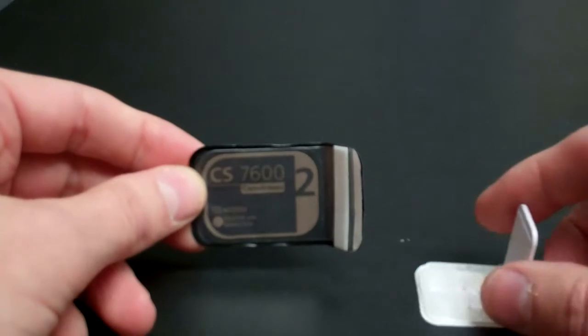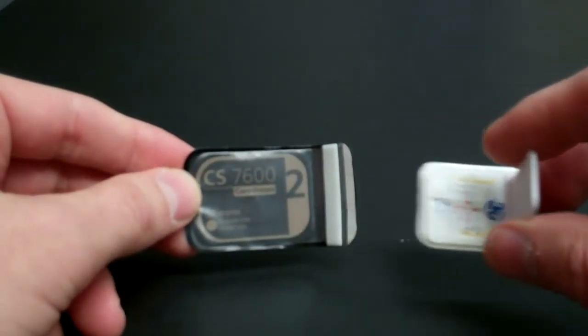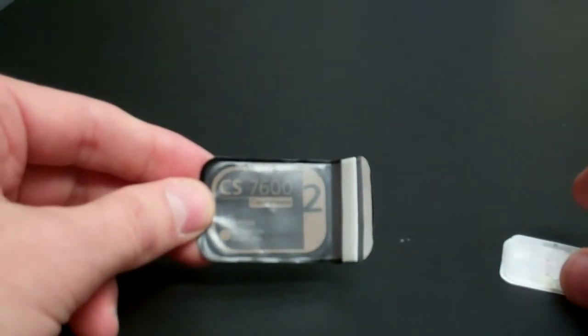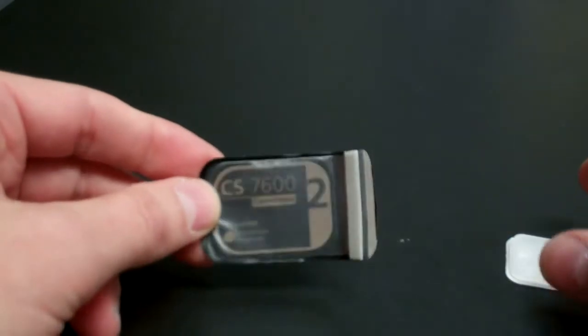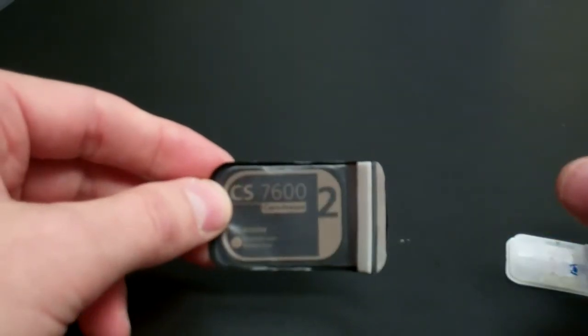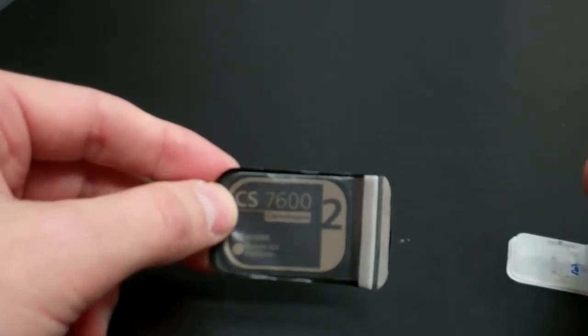This video is going to demonstrate the Unigrip version for film and phosphor plates with the CareStream 7600 phosphor plate. This is a size 2 7600 phosphor plate in the standard envelope.